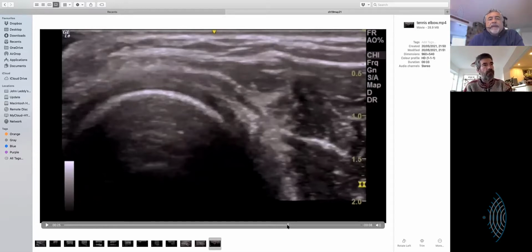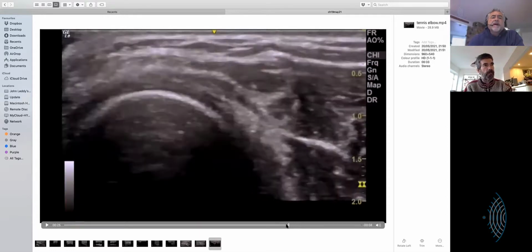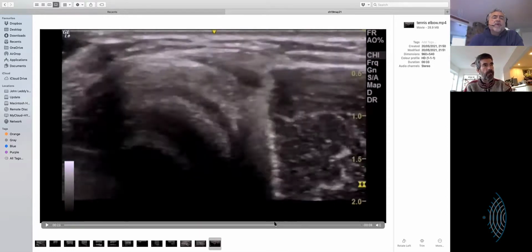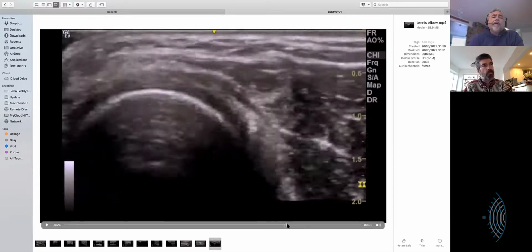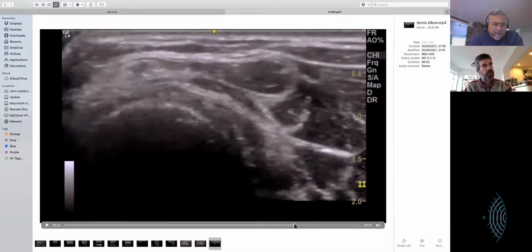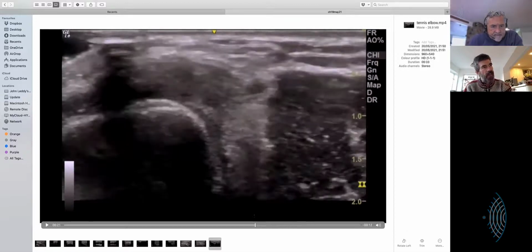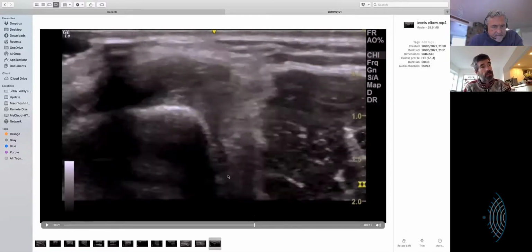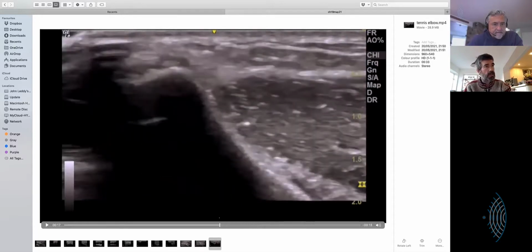Now you bring that up because is that intramuscular fascia a source of irritability, or is it just to help anatomy or to identify? It's just to help your anatomy, because you follow those fibers in, and that gives you the direction. So when you scan this bit, this is the injured part of the common extensor origin. Typically, that's normally where the pathology is. Not always, but normally where it is.